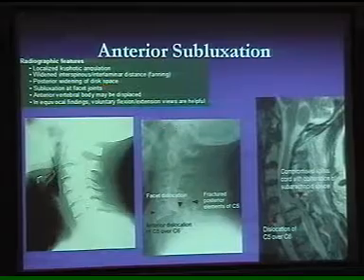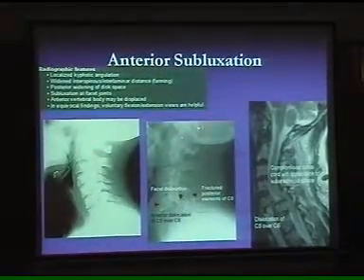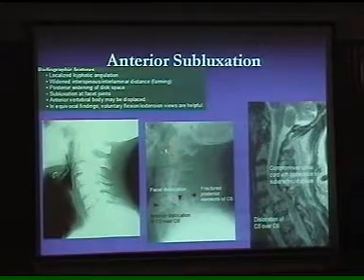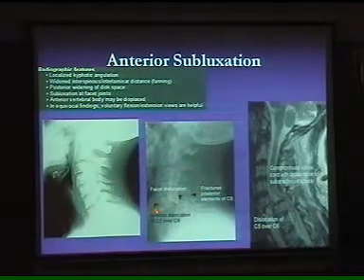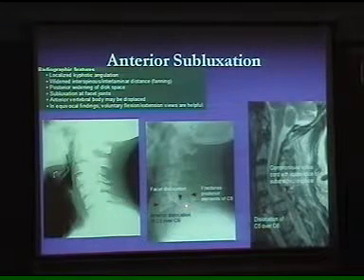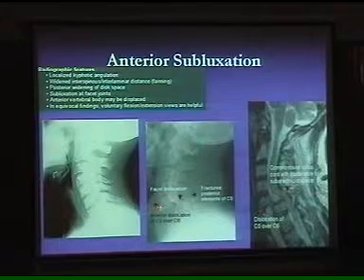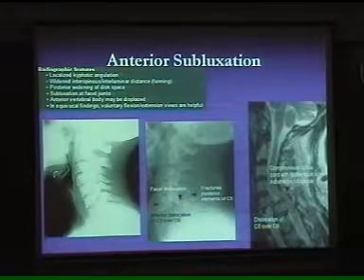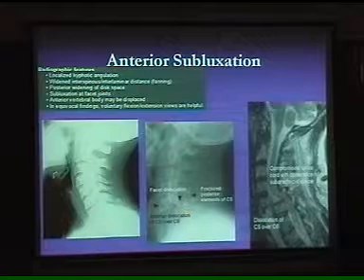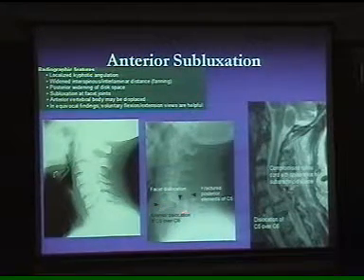Localize the kyphotic angulation. If you look at this, as we show you normal, you can see one line here. If you look at this X-ray, you can appreciate the normal lines coming up here, normal lines here, but this is not coming in continuity with this line. The next vertebra, C6, is much posterior. The question is, is the sixth one displaced or the fifth one displaced? Normally it is the one which is more fixed. This is not displaced, it's basically this one displaced. So C5 is displaced anteriorly over the C6.